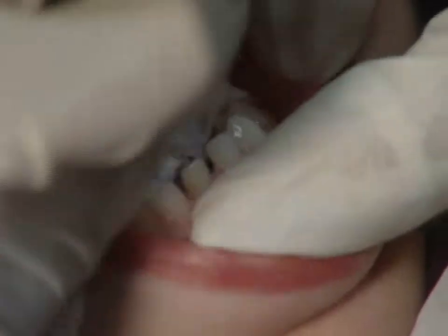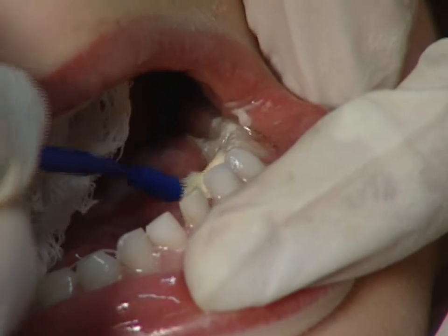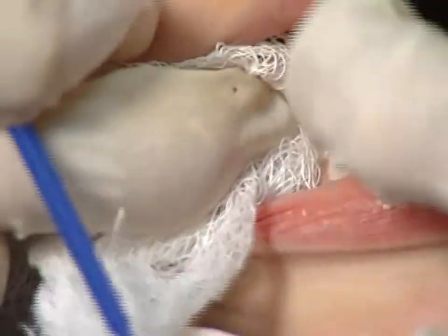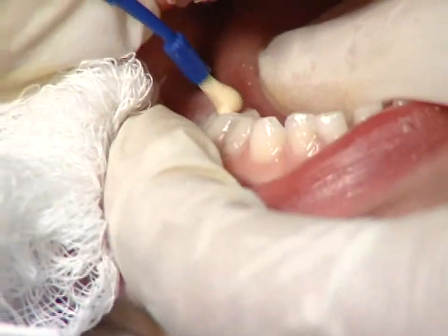When finished, move down to the lower left corner of the mouth. Dry the teeth and hold the tongue and cheeks out of the way and paint on the varnish. Move across to the right side and do the lower and upper corners of the mouth.